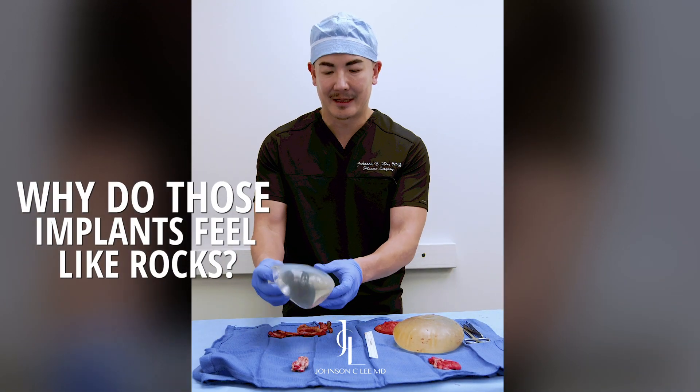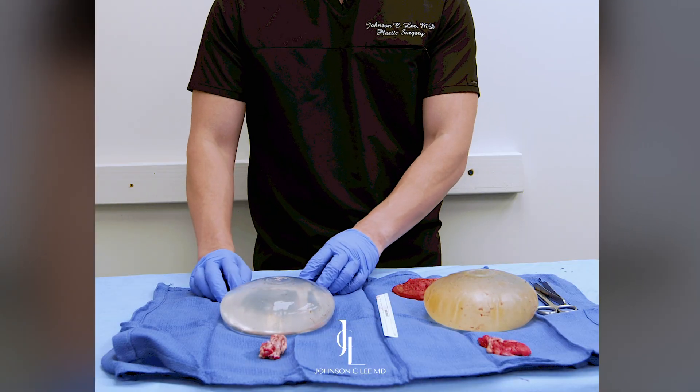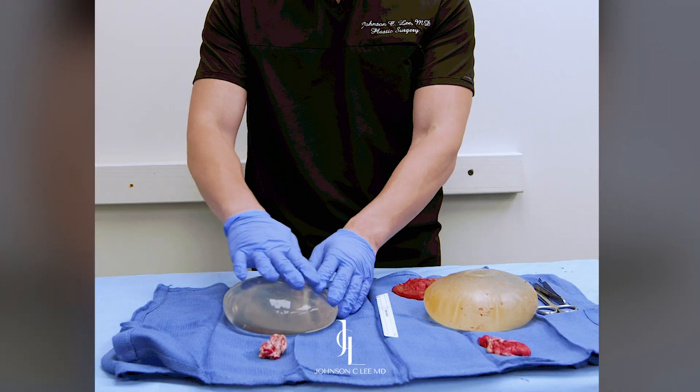Alright, so these are the implants as well as the capsules that I took out. These are saline implants, so this is what saline implants look like. On the side that didn't have as big of a capsule, you notice that the implant looks very clean.